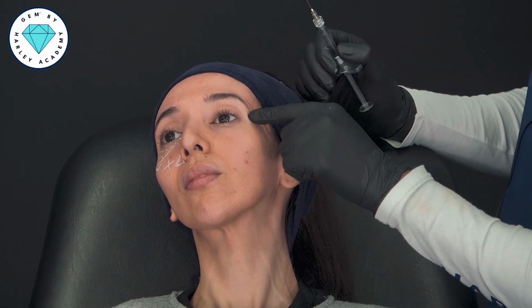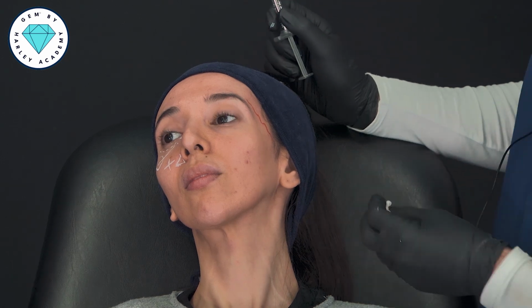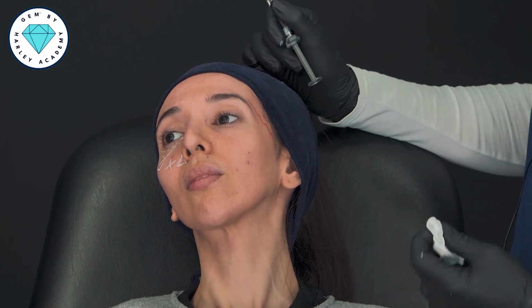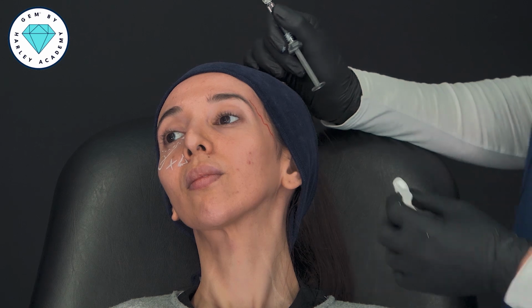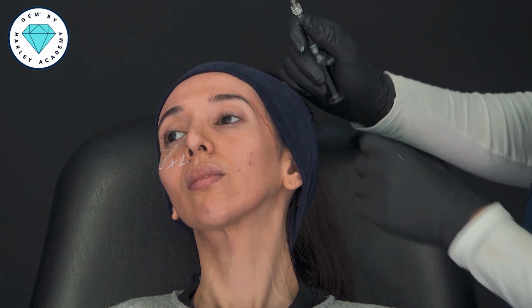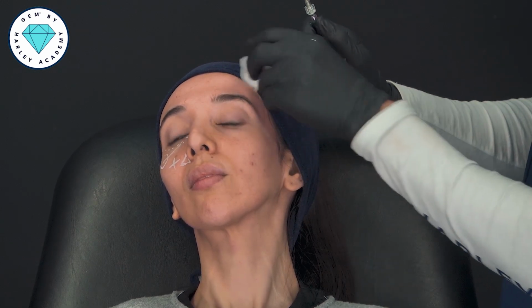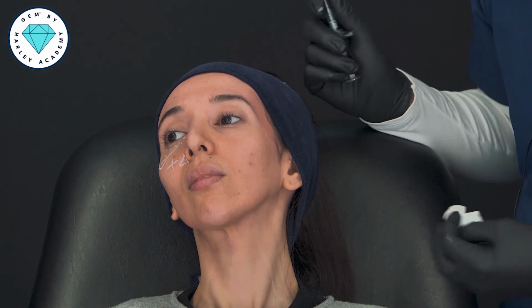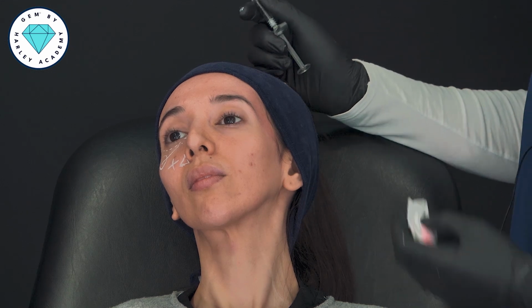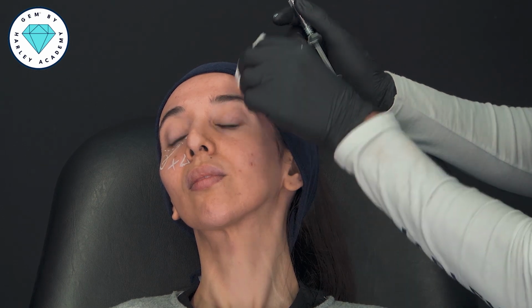I'm not so worried about that one. However, deep within the temple, we have the deep anterior and deep posterior temporal arteries. And the concern we have with deep injections is that in the deep anterior temporal artery, there is an anastomosis with the internal carotid circulation. That anastomosis is sometimes called the zygomatico-temporal artery. That one does connect with the ophthalmic artery and therefore has a theoretical risk of visual loss with treatments like a deep temple filler. And so that's why we have to be very careful with our injection technique to minimize the risk of such a complication, which would be extraordinarily rare.